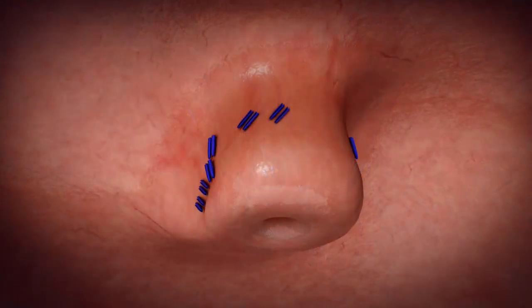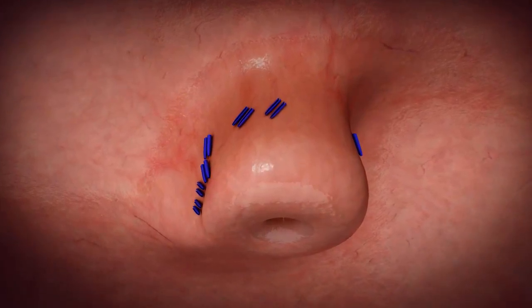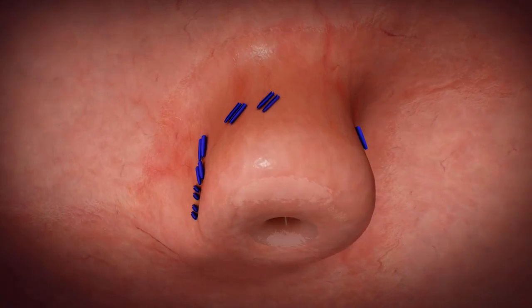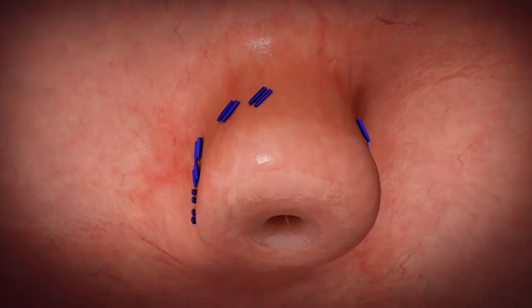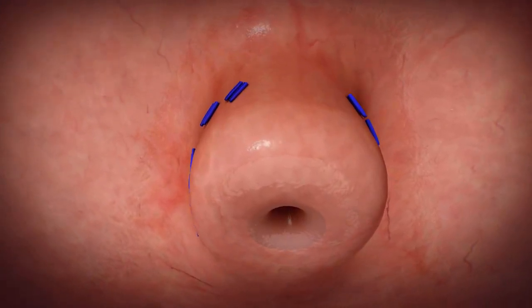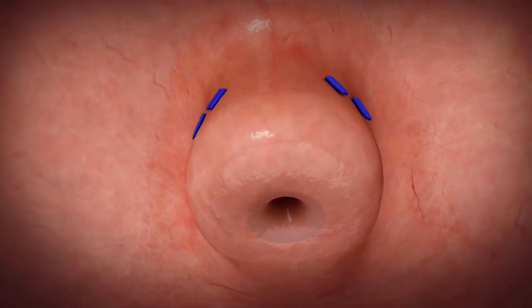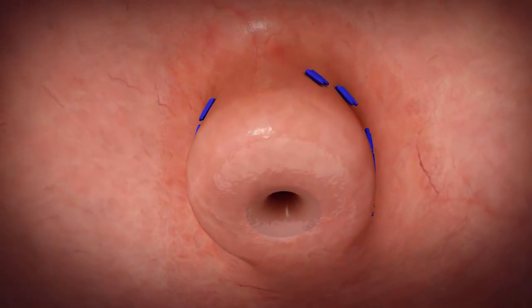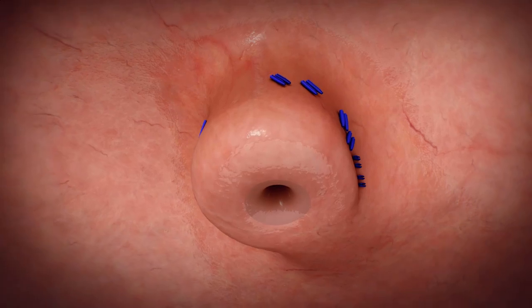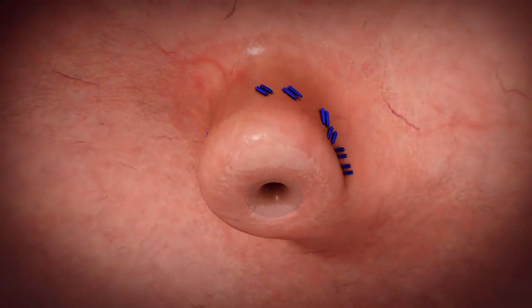Unlike traditional fundoplication, which is associated with long-term side effects such as difficulty swallowing, bloating, or flatulence, the TIF procedure with the EsophyX device avoids side effects and has an exemplary safety profile. Physicians have noted improvements on diagnostic measurements. Well-selected TIF patients report consistent, durable quality-of-life improvements with reduced reliance on medication.